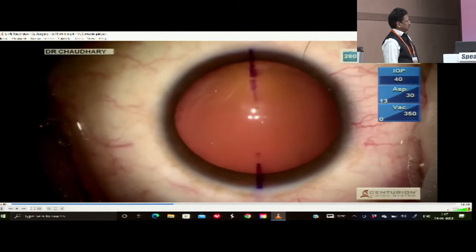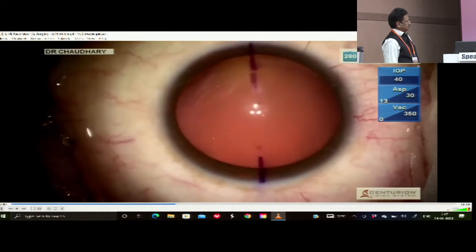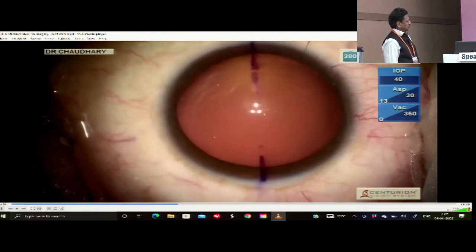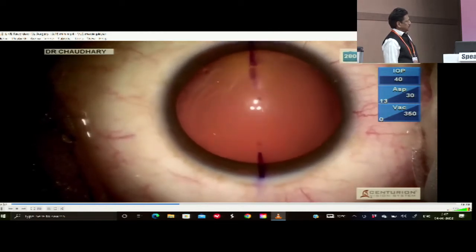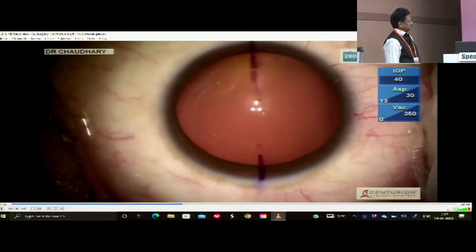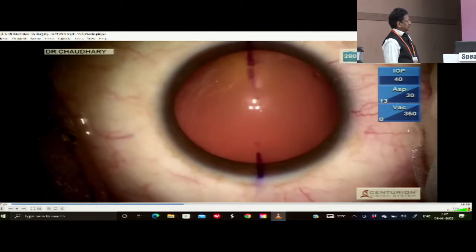Yeah. And the second best way is the bubble marker. So bubble marker, the patient is on the table, you mark the reference marks there only and ask the patient to lie down. And the third option is the digital, where you don't need reference marks. The Varion checks the blood vessel which is the most prominent, gives an angle to it, and from that basis it decides the angle for you on the eye.